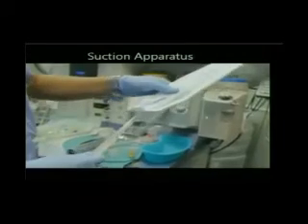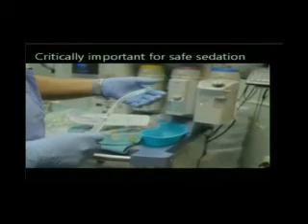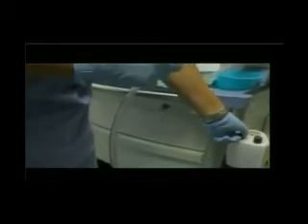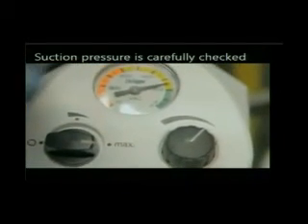So you check the suction apparatus. You have to know that it works. So here he takes the suction apparatus. This is absolutely critically important for safe sedation. You'll see him now put his hand over it, and he checks that he can feel the suction coming through that. And then he looks down at the control device here and verifies that it can actually create suction.